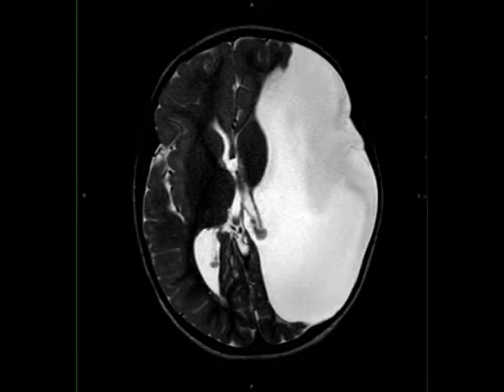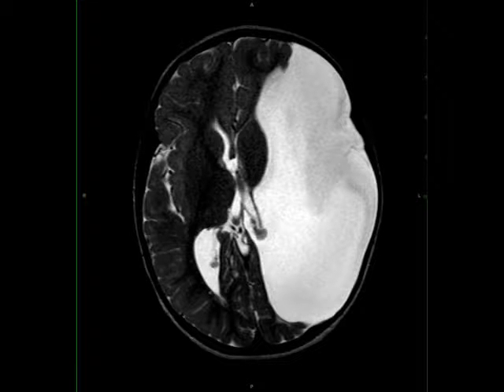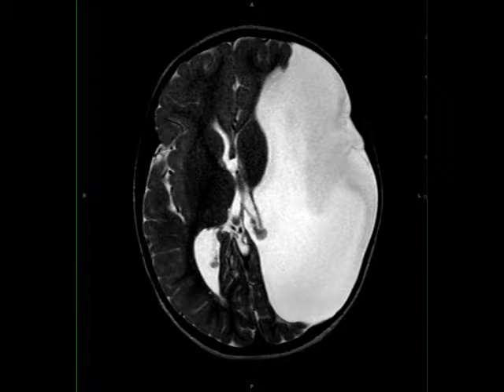A porencephalic cyst results from a focal region of cystic encephalomalacia lying in continuity with the ventricular system. The differential includes arachnoid cyst and ependymal cyst.